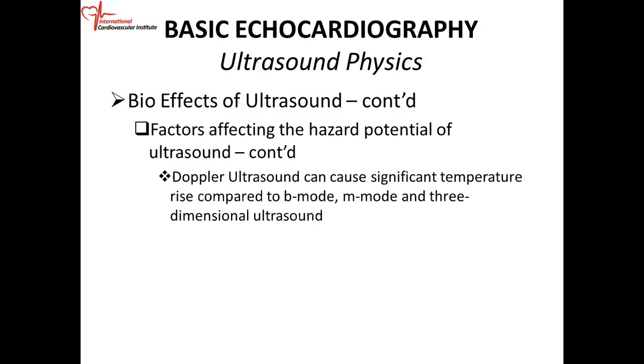As mentioned before, Doppler ultrasound can cause a significant temperature rise compared to B mode, M mode, and three-dimensional ultrasound. So you want to limit PW and CW when you're doing fetal work, because they produce more heat.